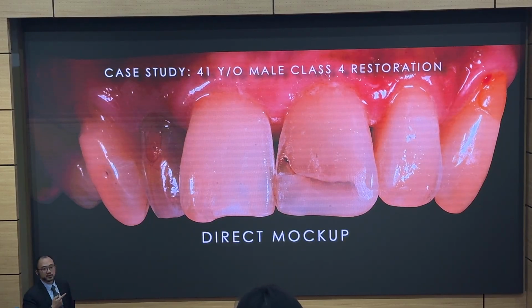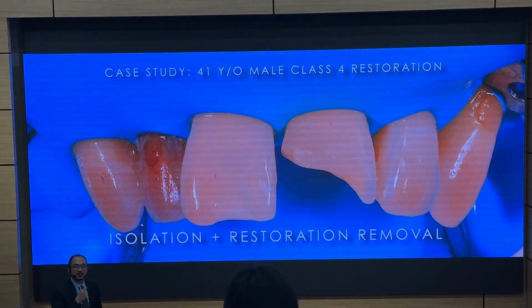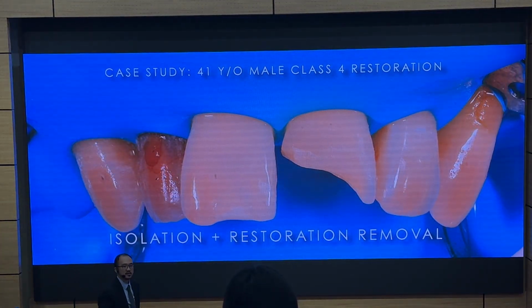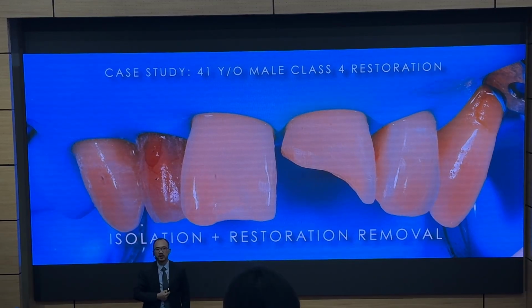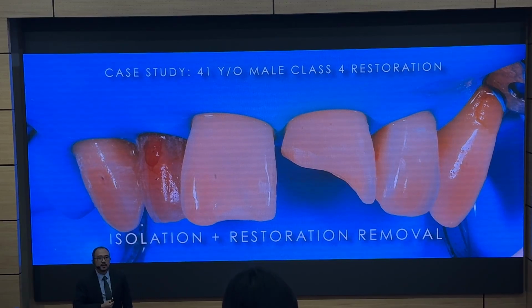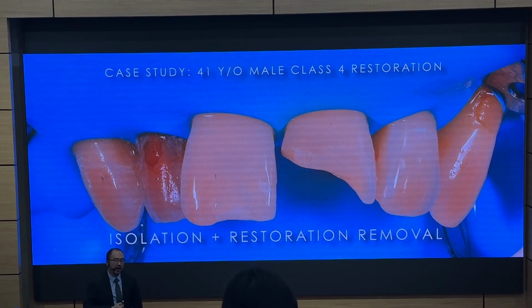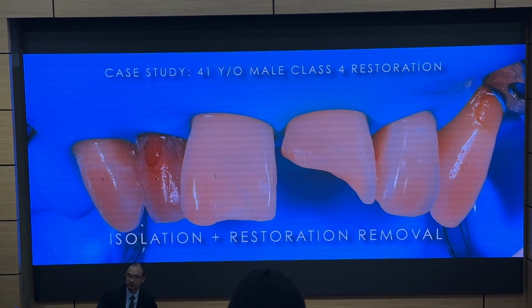Now, I want you to pay attention to this, okay? This is how he originally is. This is what it looks like after I did my cavity preparation. Some of you would look at this and say, wow, that's very aggressive, that's very invasive. The truth of the matter is that this patient has very deep decay, and after I remove the decay, there is a lot of unsupported enamel.